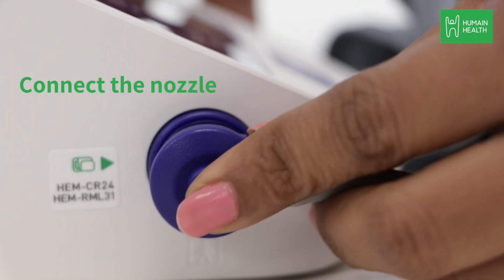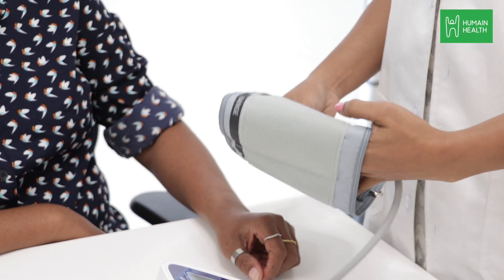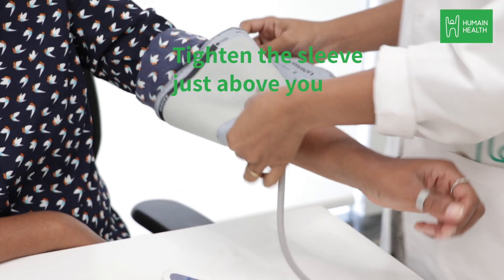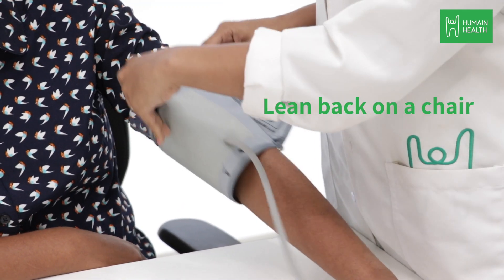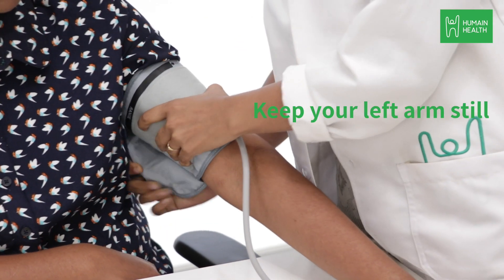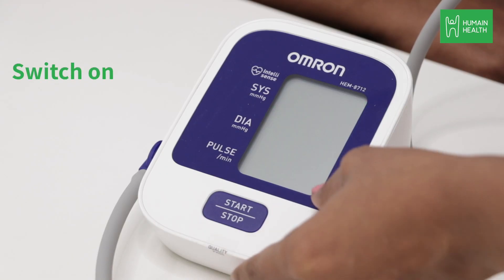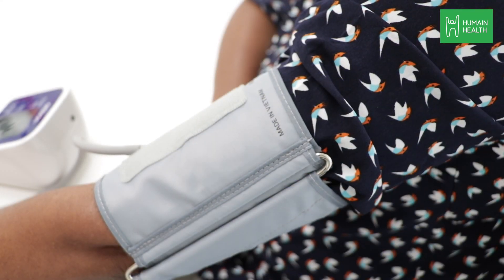Connect the nozzle attached with the sleeve to the hole on the side of the monitor. Take the sleeve with the nozzle and tighten the sleeve just above your elbow. Lean back on a chair, place your feet flat on the ground, and keep your arm still. Switch on the monitor — you will feel the sleeve inflate and deflate.